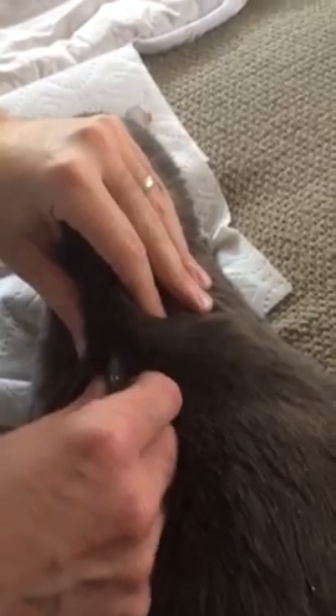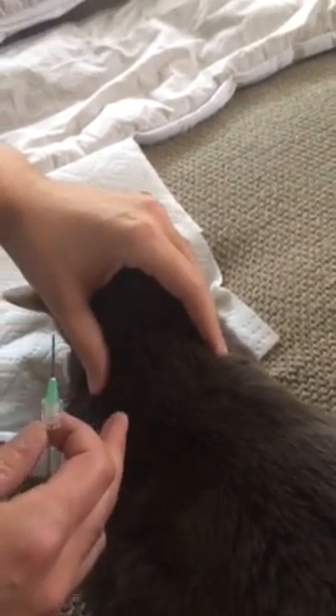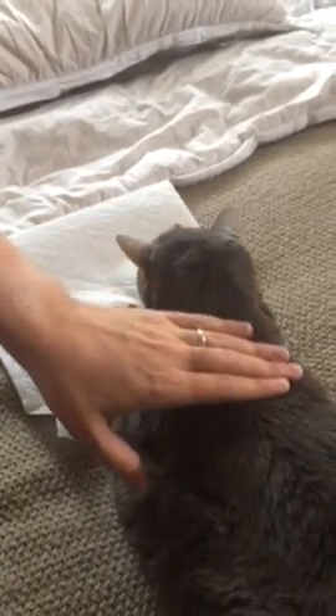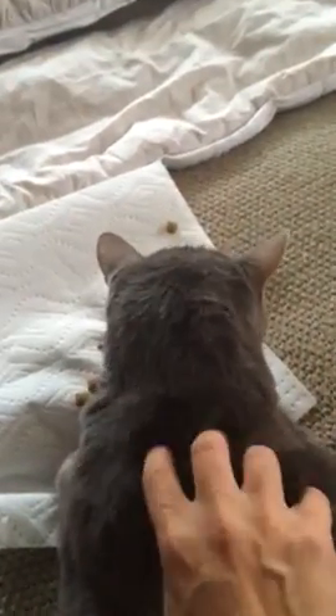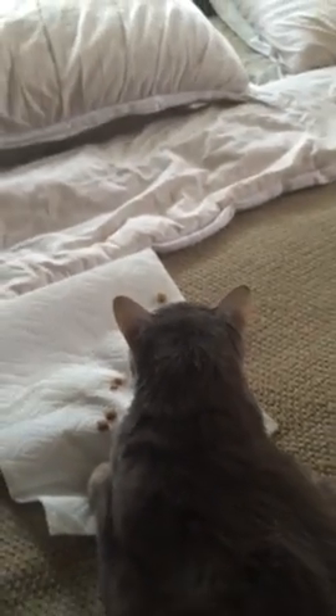With Edward, as Andrew said, you sort of grab, push down, and just pull it out. Some water or saline will usually spill out but it's usually pretty clean. You're supposed to just massage it in a little bit — and that's pretty much it. Don't forget to replace the cap: just take it and put it right back on without sticking yourself.